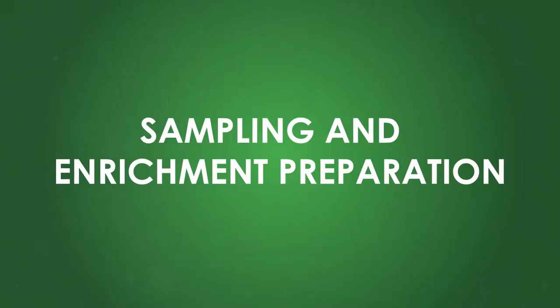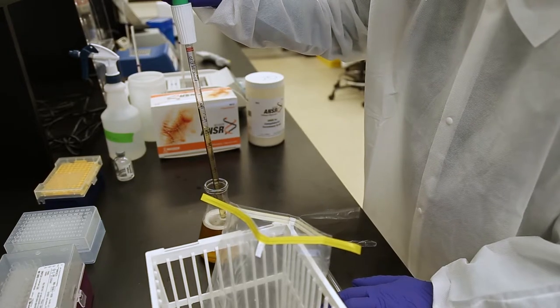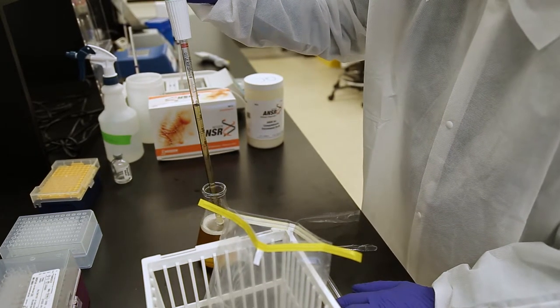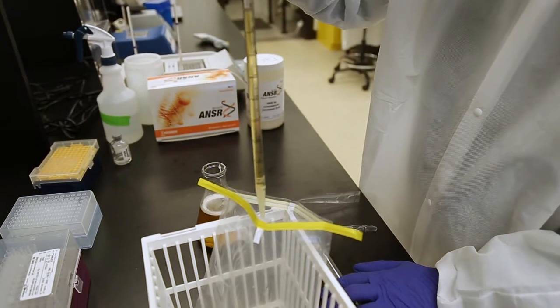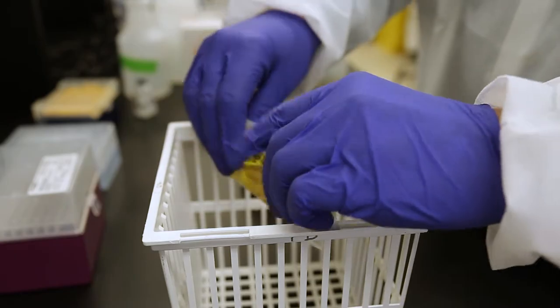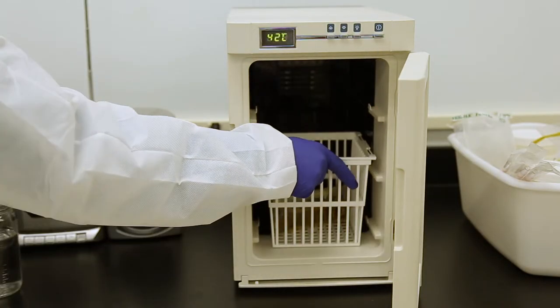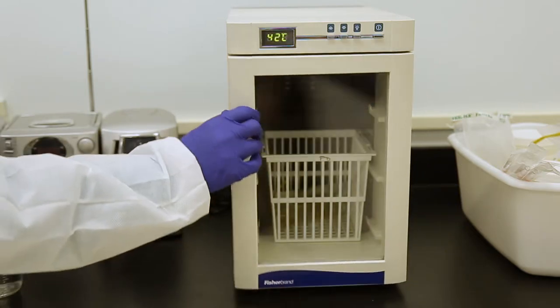Sampling and enrichment preparation. This video demonstrates the procedure using poultry rinse and environmental samples with Neogen's ANSR Campylobacter enrichment broth media. Do not autoclave the media. Weigh out the appropriate amount of sample and rehydrated media into a sterile stomacher bag. Close up the stomacher bag and incubate at 42 degrees Celsius plus or minus one degree for the amount of time listed in the kit insert.